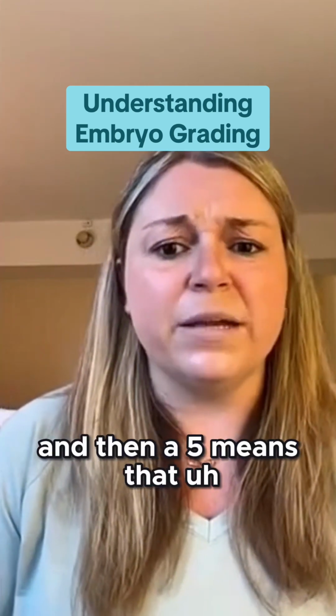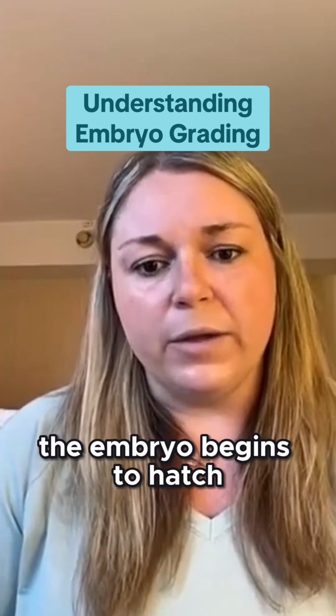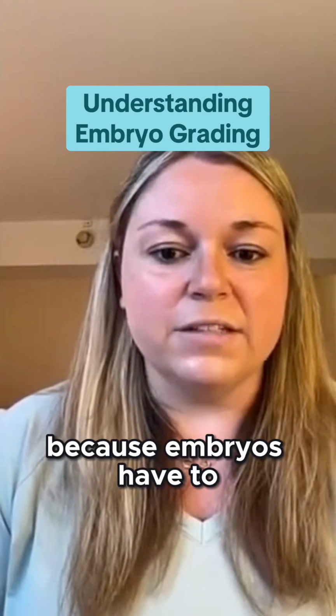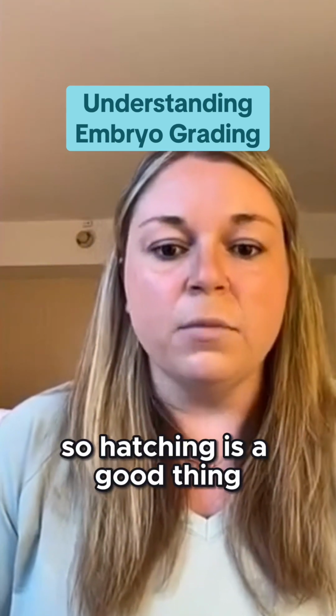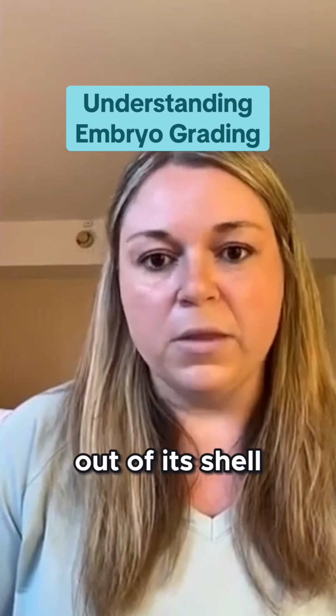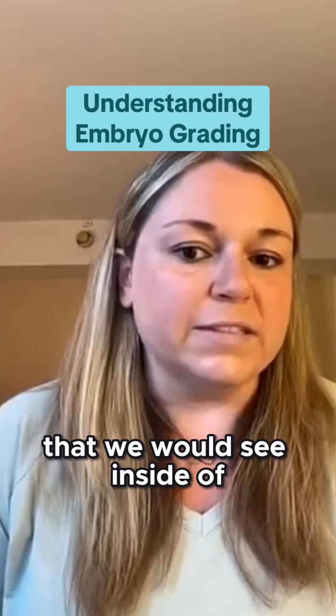And then a 5 means that there's actually a hole that has been created in that shell, and the embryo begins to hatch from that shell, which is good. We want that to happen because embryos have to hatch in order to implant into the uterine lining. So hatching is a good thing. And then 6 means that it's fully hatched. So it's completely out of its shell. And that would be the most advanced stage of development that we would see inside of the lab.